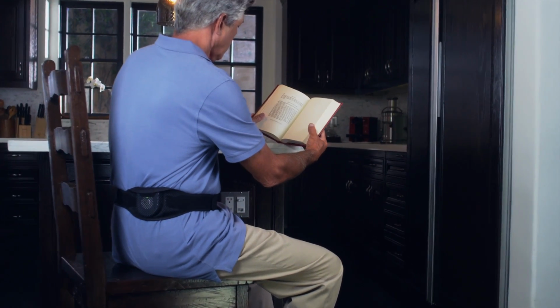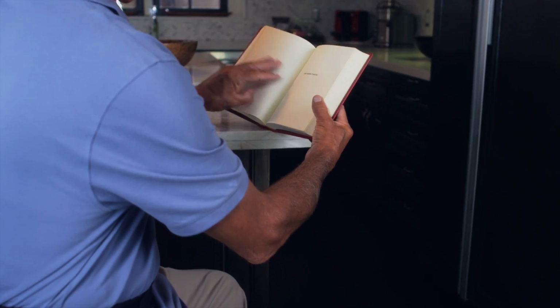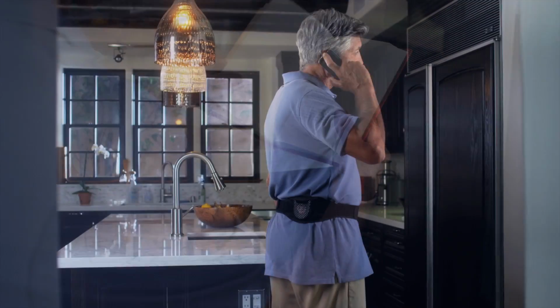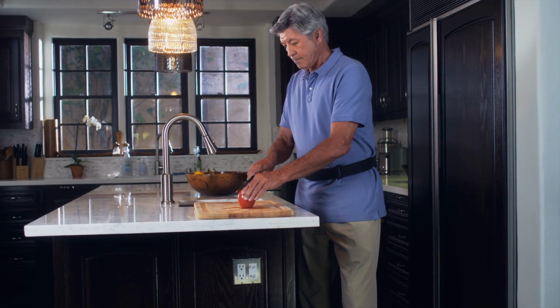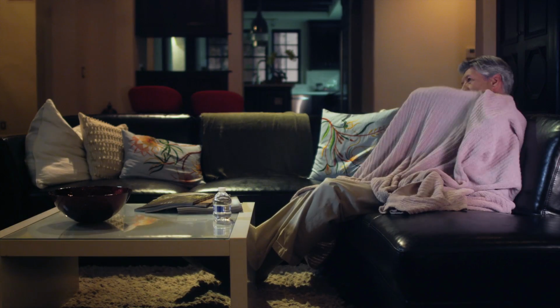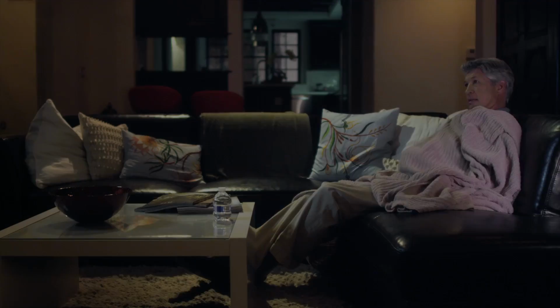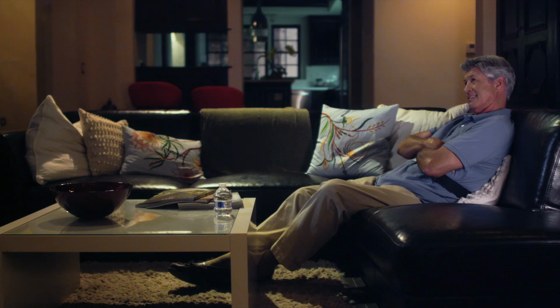The charger should also be well ventilated for best charging results. You can accomplish this by leaving the charger or charging belt exposed to the air while charging. Things that may prevent good ventilation include wearing heavy clothes over the charger, wrapping yourself in a blanket, and pressing the charger against a pillow or upholstery while charging.